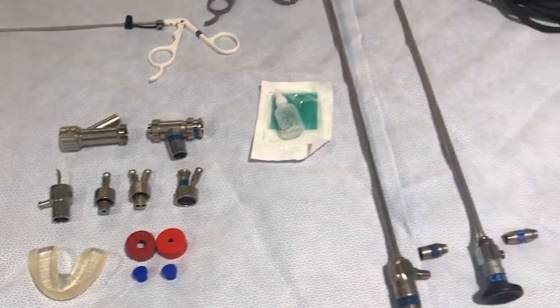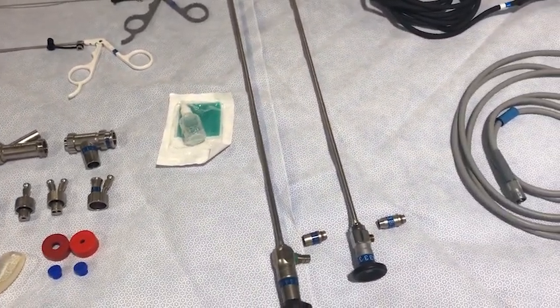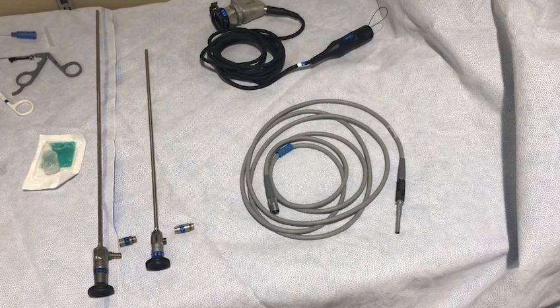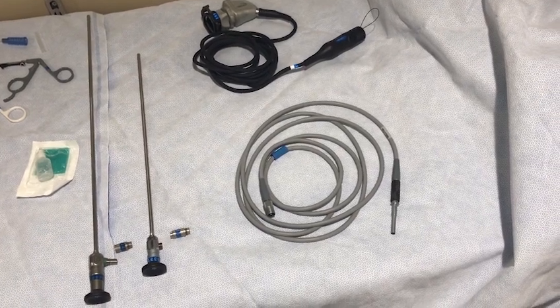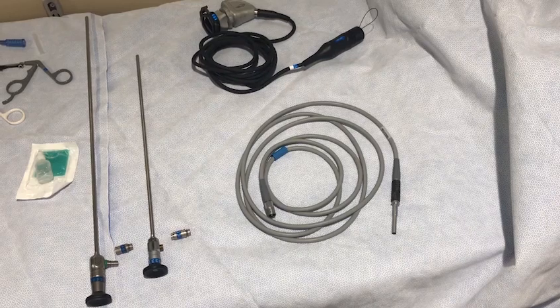Additional accessories include a universal instrumentation barrel, anesthesia connector, and anti-fog solution for the telescope lens. A telescope of the appropriate length and their corresponding connectors is then chosen. Cords for the telescope light source as well as the camera lens are also needed. These may look different depending on the type of processor in your hospital. This camera lens is designed for a Stortz processor.